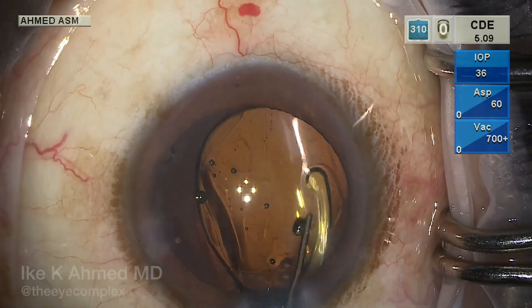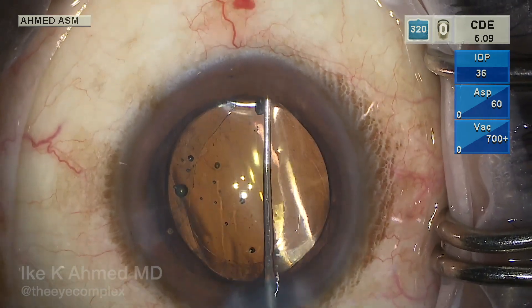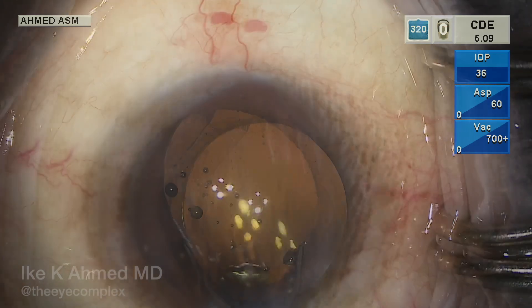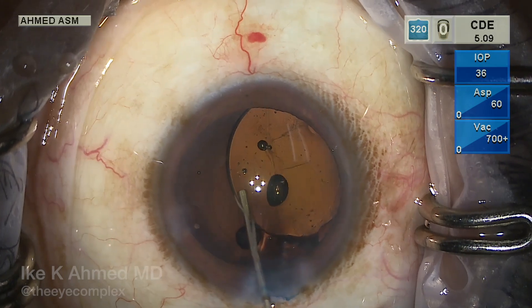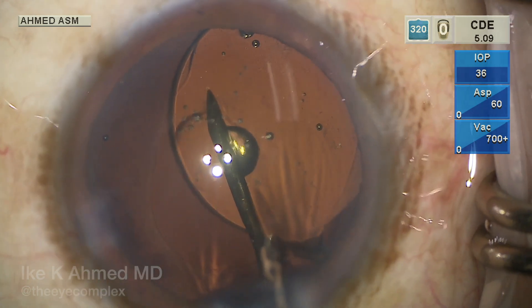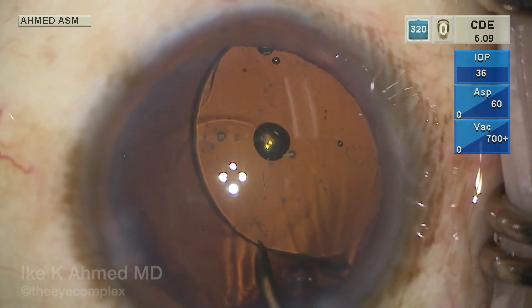Here the toric lens is inserted. The marks are aligned — inkless marks on the cornea with the patient sitting temporal — and the axis of implantation is 170 degrees. The haptic-optic junction is visible beyond the anterior capsule overlap. We are concerned that leaving the lens like this may not be well supported, especially with capsule contraction. So we will proceed with a posterior capsulorhexis. The idea is to keep the lens in the capsular bag but prolapse the optic through the posterior capsulorhexis — the posterior optic buttonhole technique.